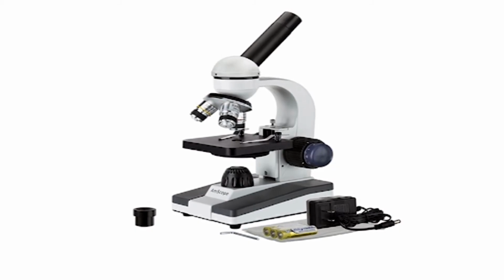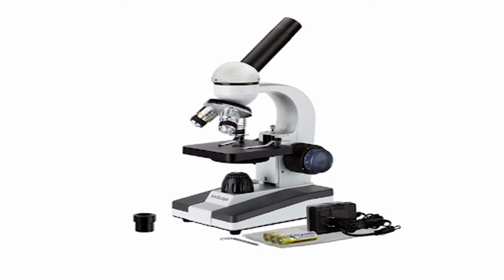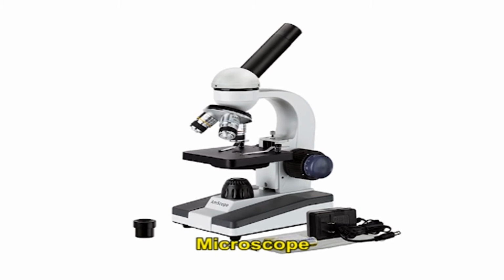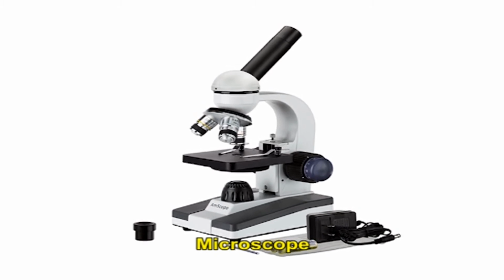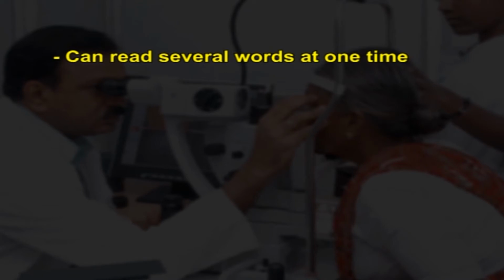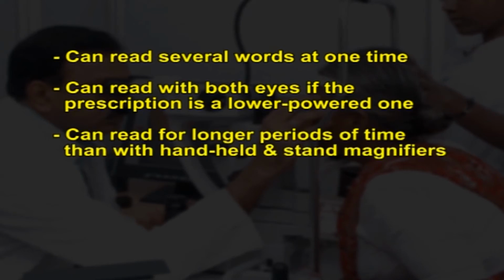Magnifying reading glasses. Magnifying reading glasses allow an individual to read for longer periods of time. They are also called microscopes because they produce magnified images of small words and objects. The advantages of magnifying reading glasses are, can read several words at one time, can read with both eyes if the prescription is a lower power one, and can read for a longer period of time than with handheld and stand magnifiers.